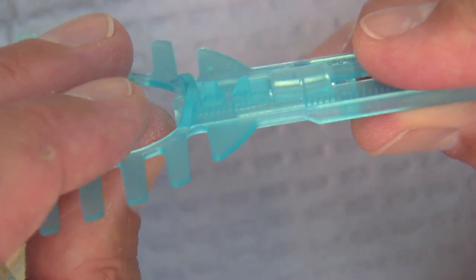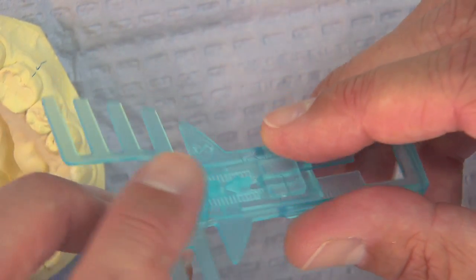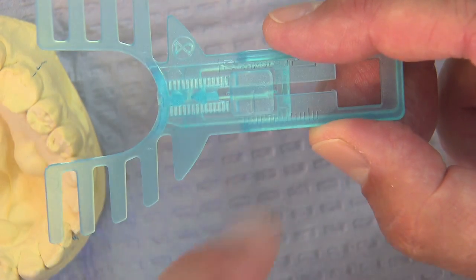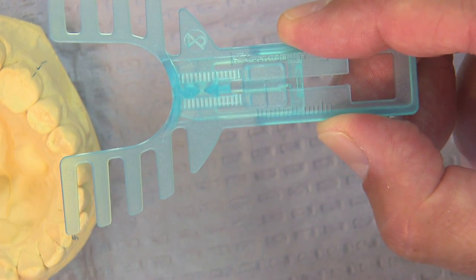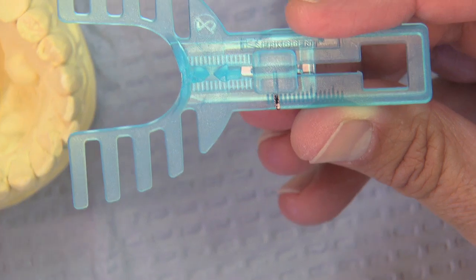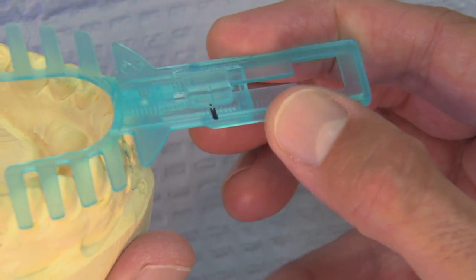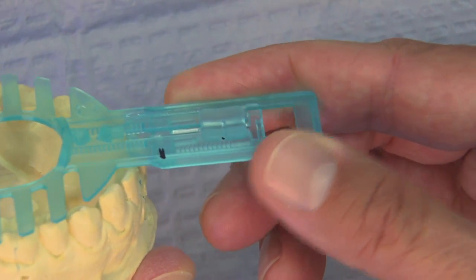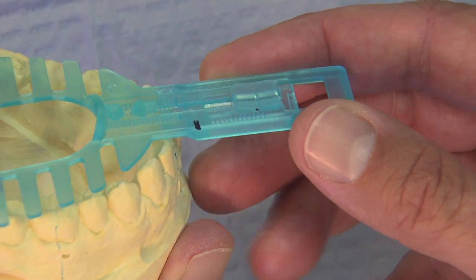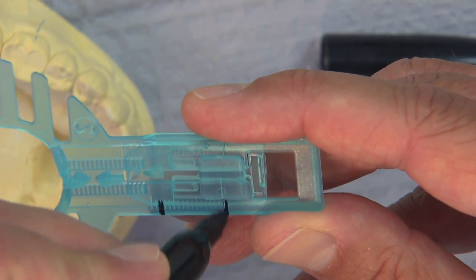And wherever their bite happens to be, if they bite a little farther anterior, we can slide it forward so they bite into it and we find wherever they're comfortable. Then we're going to take a little magic marker and just make a mark on here to show where that area is. So for example, we will mark the patient's normal bite being right there. And then we'll have the patient with 24 and 25 in the lower notch. We'll have them protrude as far as possible. And they'll put their jaw out as far as they comfortably can, and we'll tell them to hold it there for just a second. And while they're at that position, we'll mark again where that is.